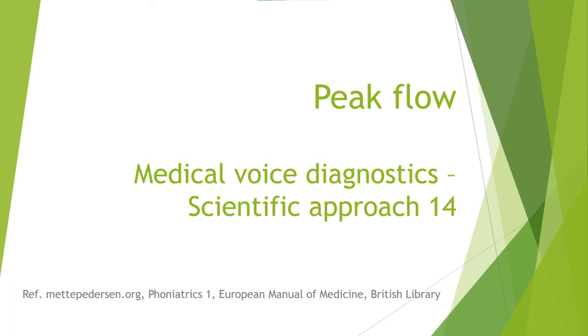Hello, and welcome to today's episode on peak flow. The peak expiratory flow is the maximum speed of expiration measured with a peak flow meter in liters per minute.